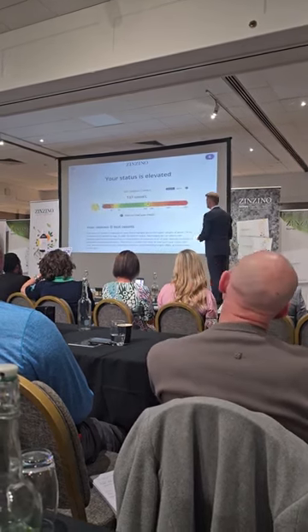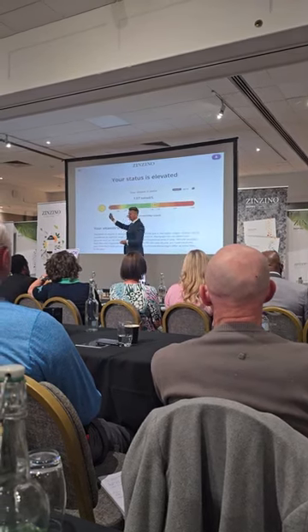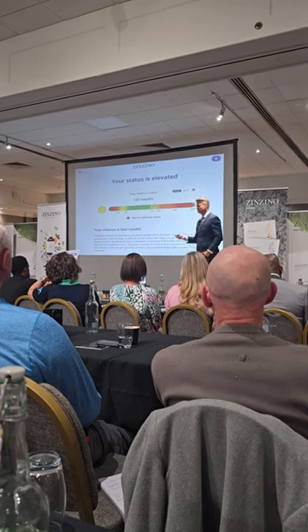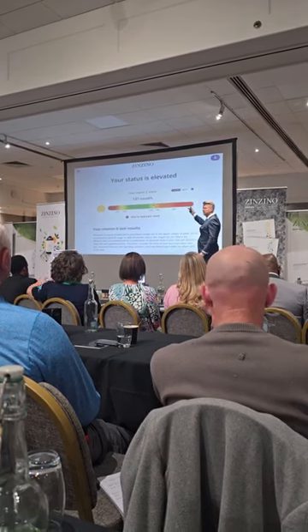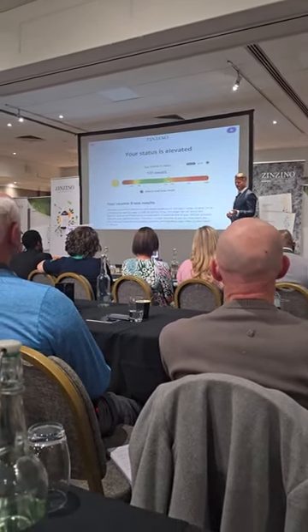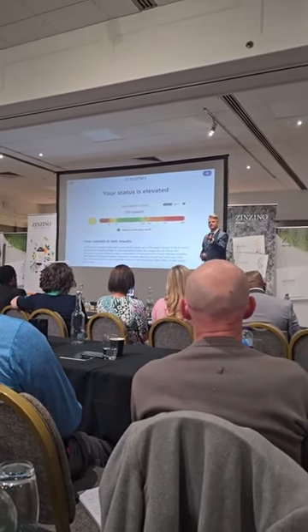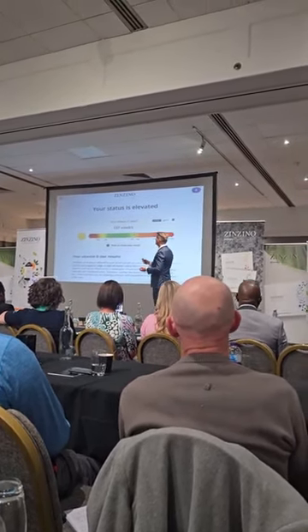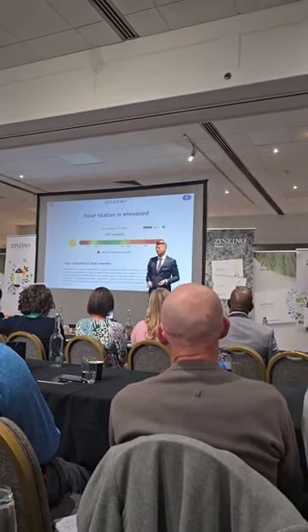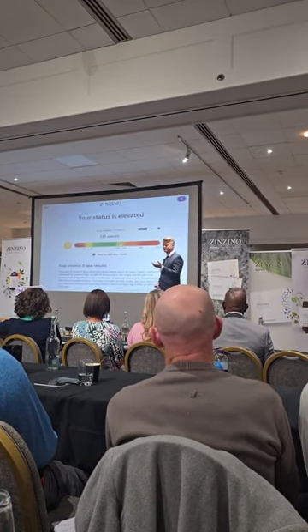I would say the purpose is to find out if you're in the low red region here, you're deficient in vitamin D, and you need to start taking supplements. And then to see if you are in the high red range, having toxic levels of vitamin D, because this can also happen, and then you have to stop taking supplements, right? So this is the main purpose. And then of course people would like to know if they are at 50 or 100 and you want to reach maybe, I don't know, 130, 140, something like this. This is the purpose of the test.